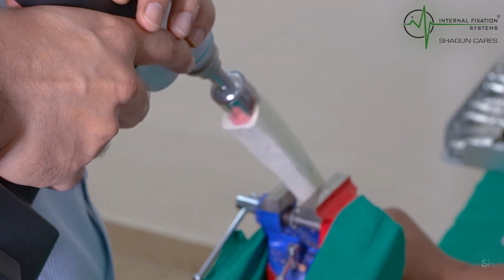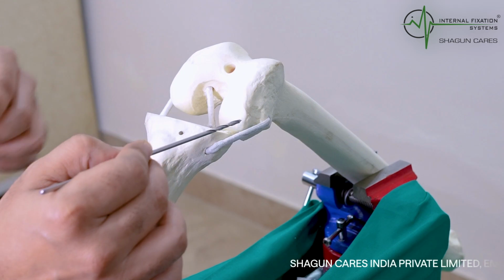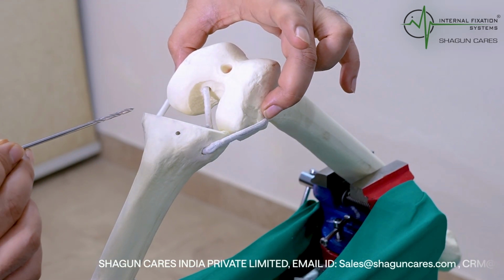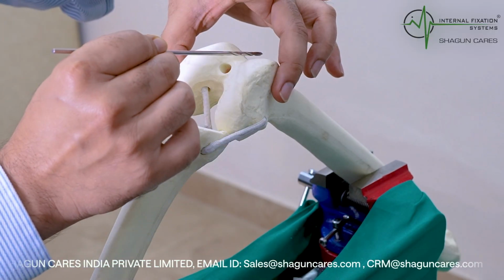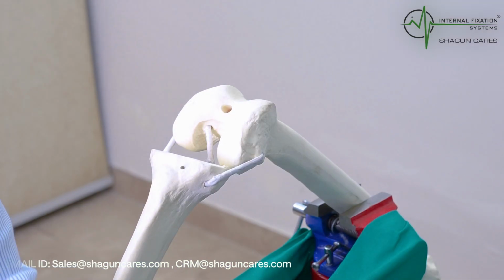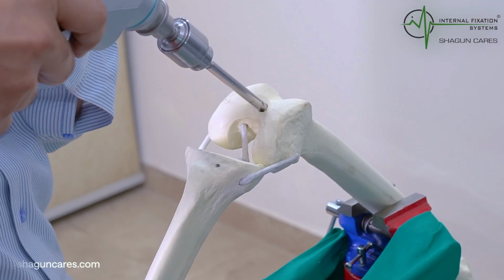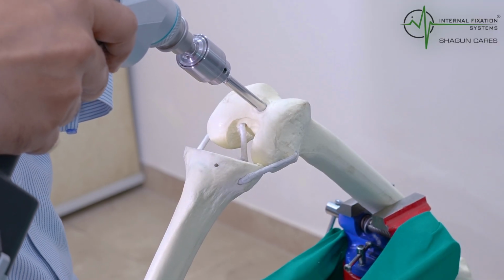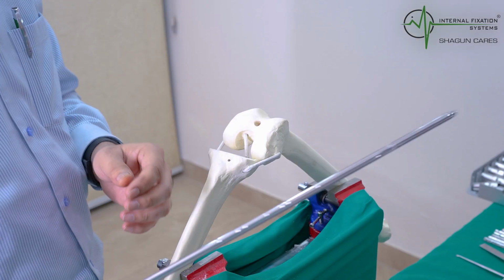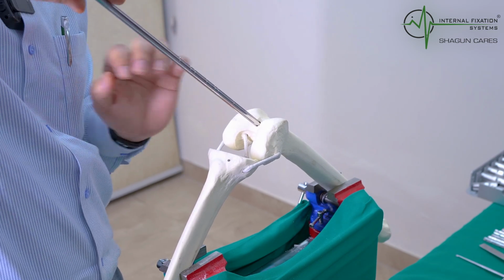This is the condyle where we need to take it. This is important. Where do we mark it? The two epicondyles, medial and lateral, you make an axis, and then the longitudinal axis. Your entry point is slightly above that. So first you need to make an entry with a small hole, and then you put it. Then we need to enter. This is the same like what you see.